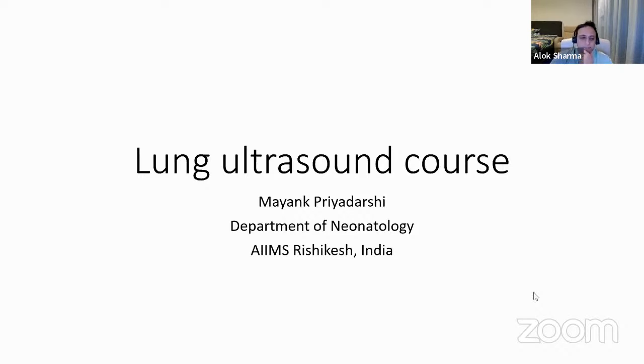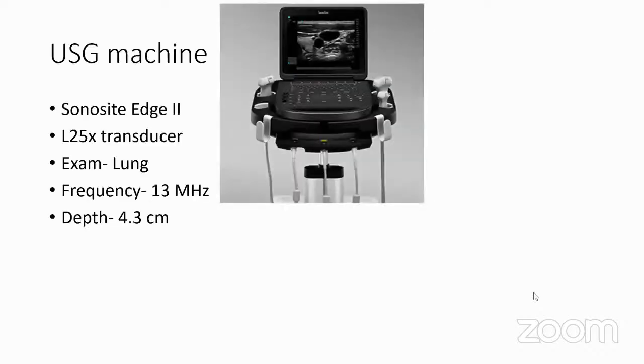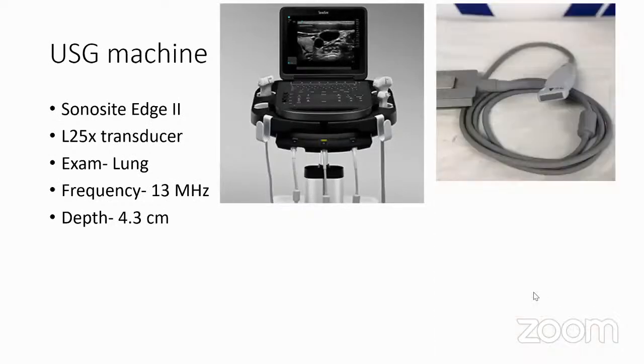Sure. So, good evening, everyone. Today, I'll be presenting two cases for the peer review. My name is Dr. Mayank Priyadarshi. I'm working as a consultant in the Department of Neonatology at AIIMS Rishikesh, India. So, the machine which I have been using is a Sonosite Edge 2 machine, which looks something like this, with a linear probe, which is the L25X transducer, ranging from 6 to 13 megahertz.